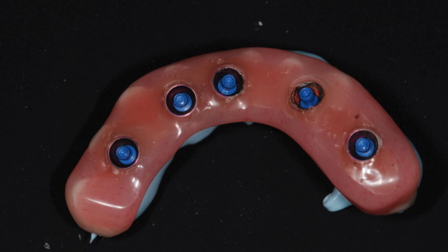Right. So this we will generally use initially after surgery, and depending on how the patient's doing, we can leave these in 30 days, 45 days, a week. It really depends on what the patient is experiencing, if they're getting enough retention or not. So these are going in the day of surgery. We're looking at the undersurface of the denture now. Generally, on lower cases, all on 4, all on 5, we don't like to put molars on the initial prosthesis. So we're at the premolar range, and you can see the blue mousse underneath is what we're going to use to seat it on top of the prosthesis that's there.